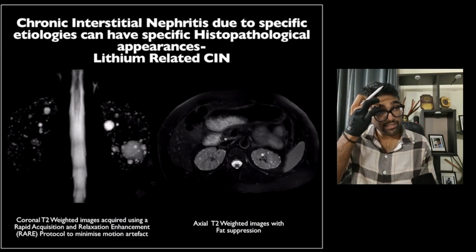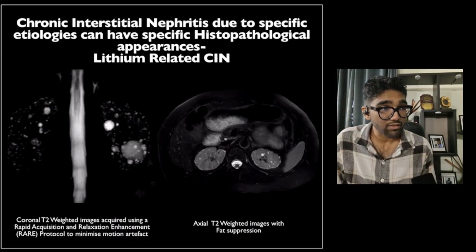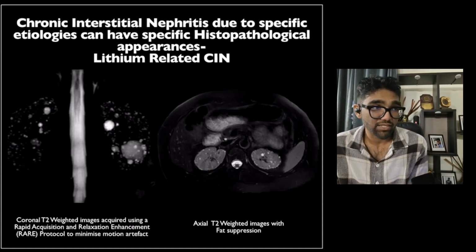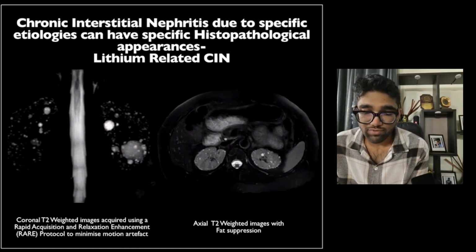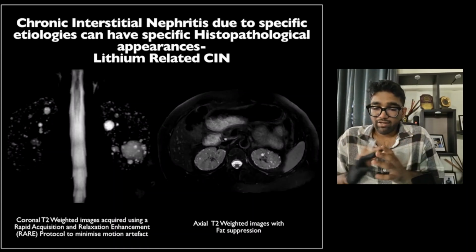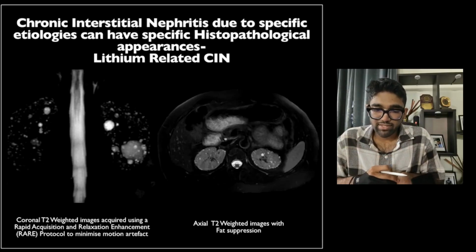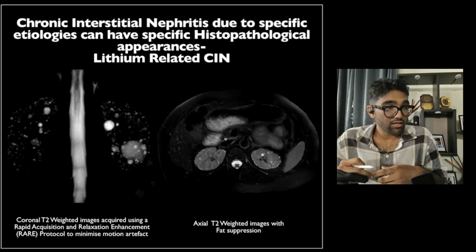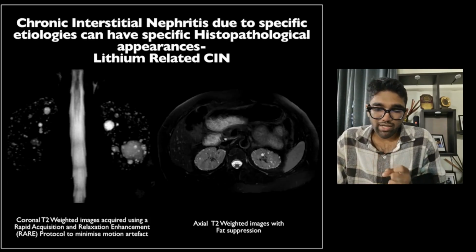So as we've discussed, lithium enters your cortical tubule epithelial cells via the apical sodium channels, the ENaC channels, and then goes and inhibits your GSK3 beta, the kinase. That changes the cytoskeletal structuring of the tubular epithelial cell in the cortical tubule, and those cells then lose their planar cell polarity, and that eventually results in tubular dilatation and the formation of these cystic changes within the kidney. As you can see, the cysts here are all very small, and they may even be visible on imaging. This can even be picked up on ultrasound, and often a good radiologist will do that.